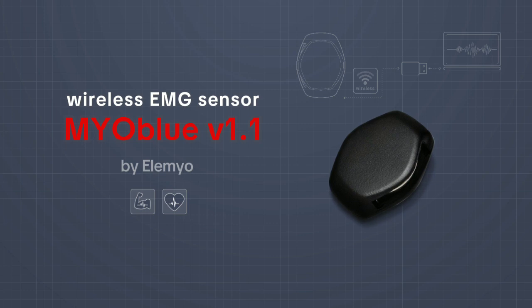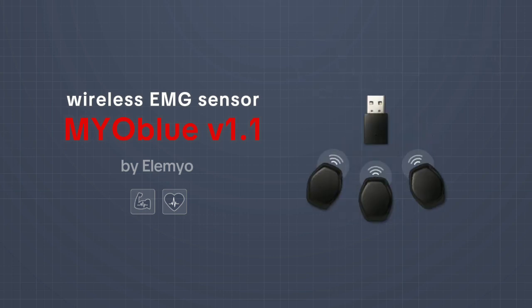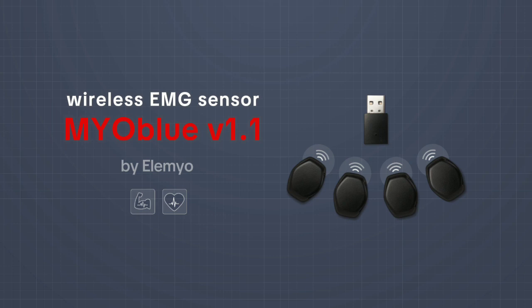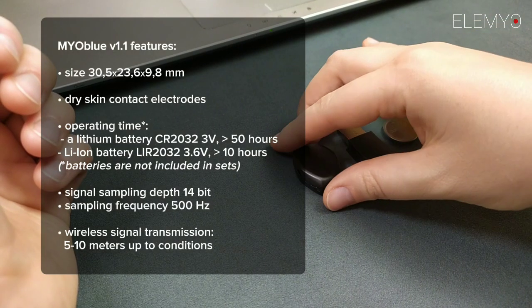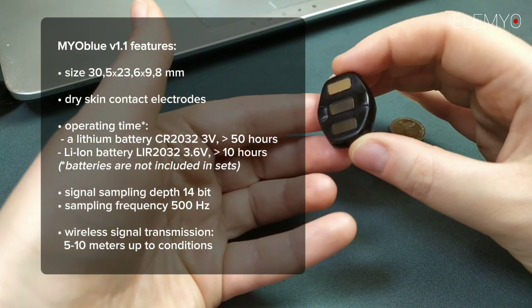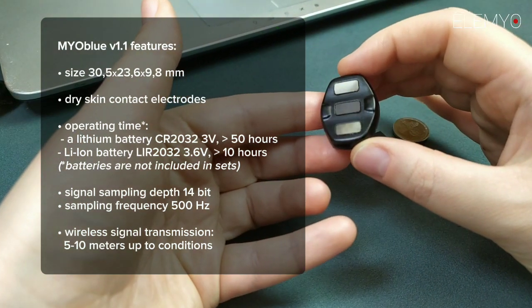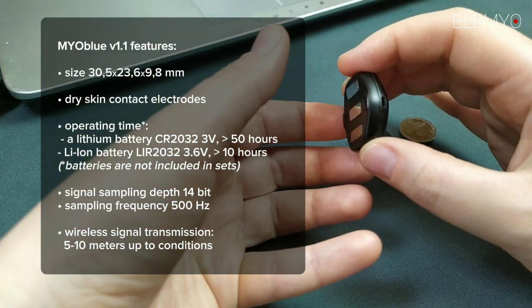The Myoblue V1.1 is supplied in sets of two, three or four EMG sensors with one USB dongle. The sensor has dry skin contact electrodes, so you don't need any conductive gels to use it.